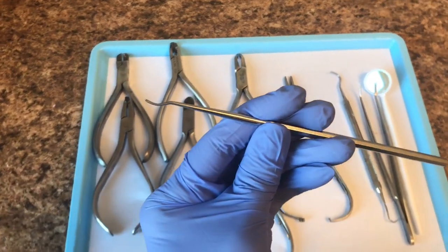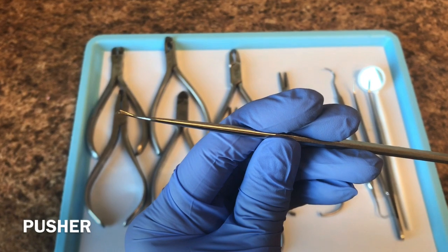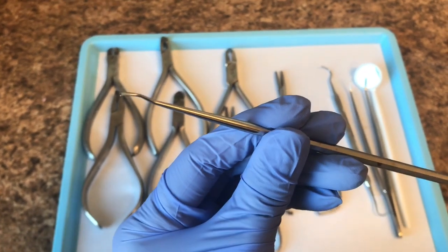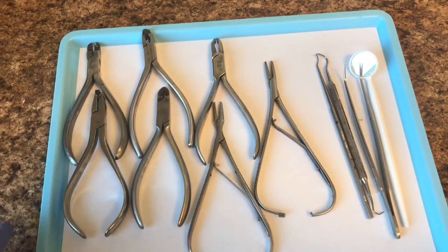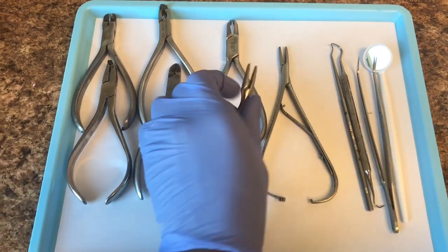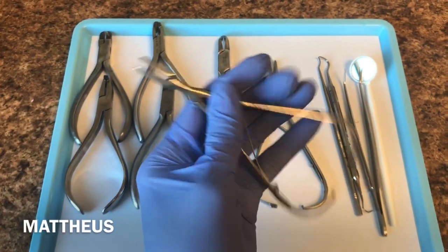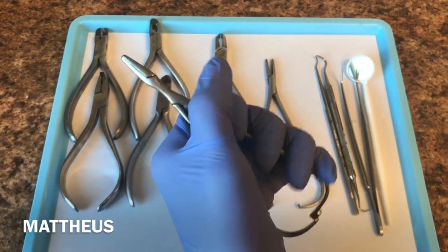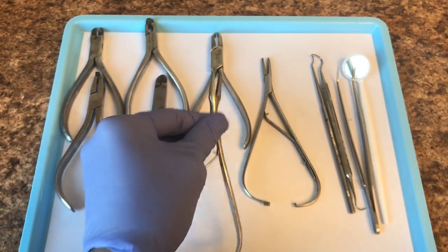We have here a pusher. If you look closely, it has a small little U-shape, and it's used to help push the wire into the bracket while you tie in the bracket with the color. We have here a matthew — we have two here on our tray. It basically closes and opens just like that, and we use these to put the colors on the brackets.